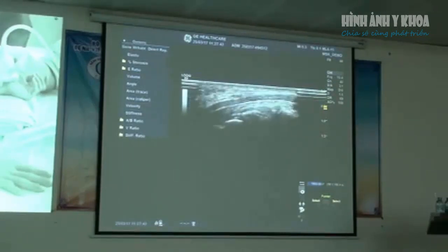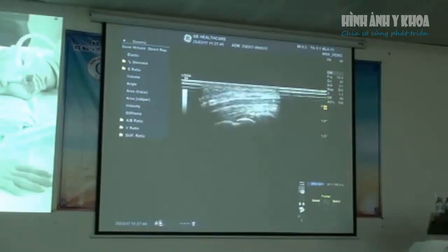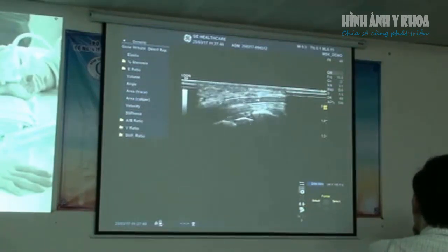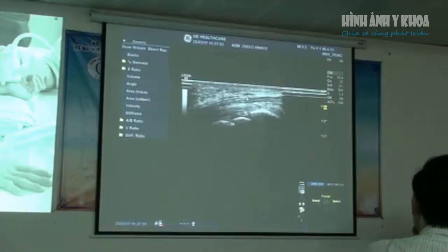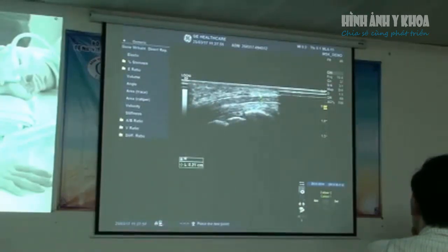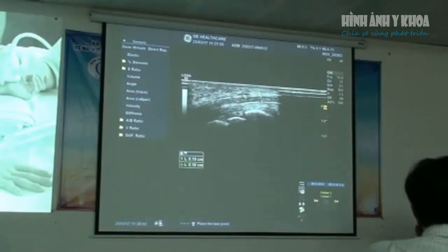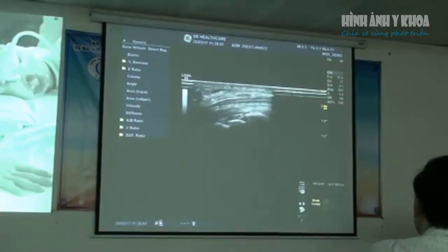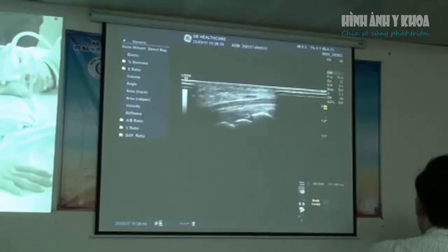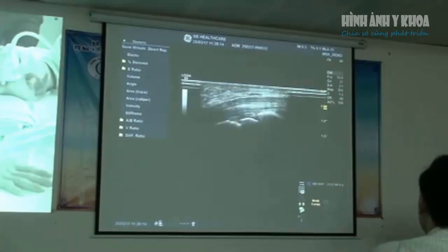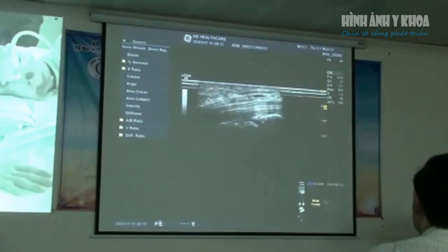The other thing we look at is in the longitudinal plane — make sure there's no calibre change as it comes down through that retinaculum. When you're doing the dynamic nerve assessment, you must use very light probe pressure. If you push too hard, you'll actually stop the nerve from moving, so you need very light pressure.